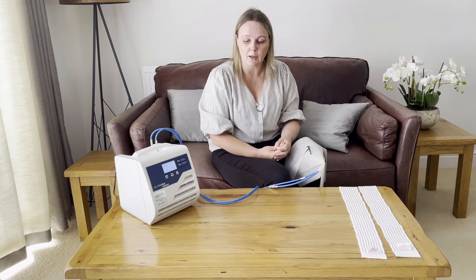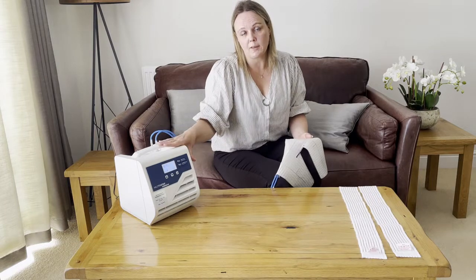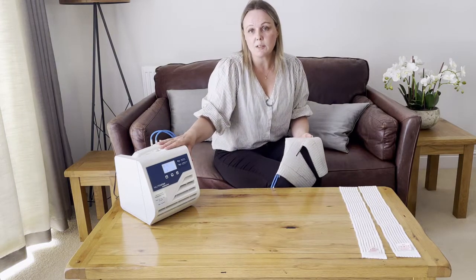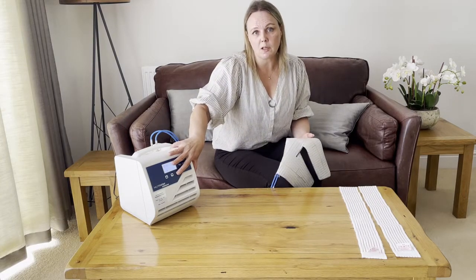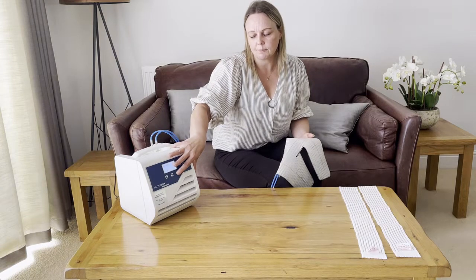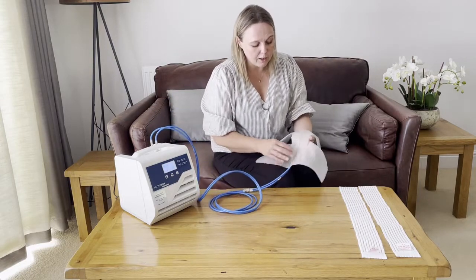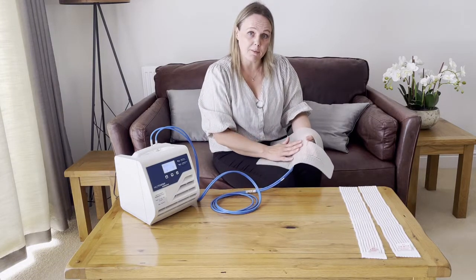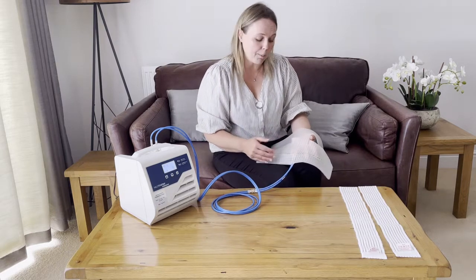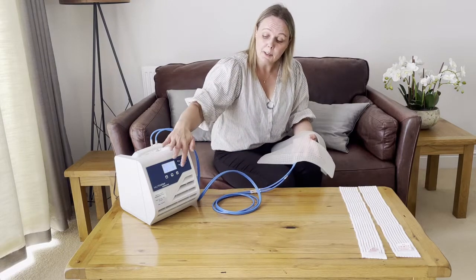I'm going to start the water flow. For this demonstration I'm using one of the HTP1 devices. It's very important that you activate power mode — to do that you hold the start button for at least three seconds. If you activate it in eco mode there won't be sufficient water travelling through the cuff, so it will feel less inflated and won't be able to cool properly because the water won't be travelling fast enough.